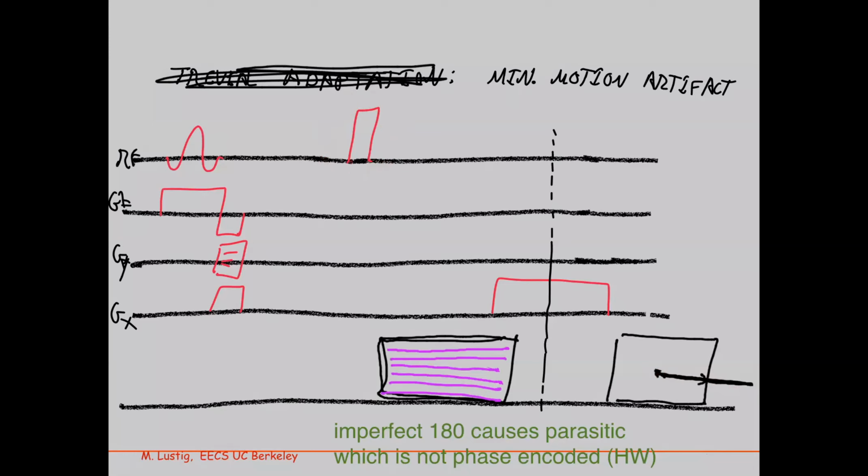The contribution coming from the rest of the spins would collect the right thing, because whatever's been excited over here will collect this line and put the line in the right place, and then collect this line and put the line in the right place. But in addition to this, they get this data, combined with this, put in the exact same place.